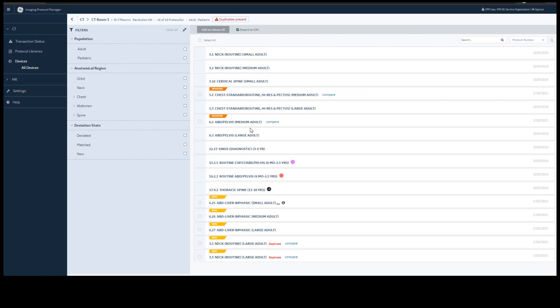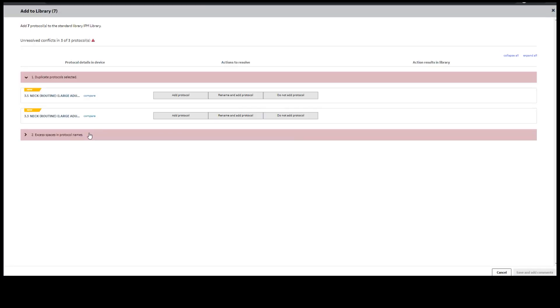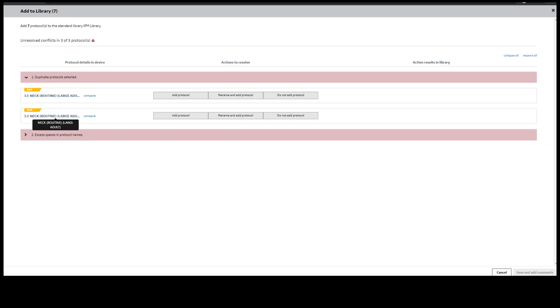Next, you can decide which protocols you want to add to your library. Select All protocols and Add to Library. This is a duplicate management screen. This will allow you to compare these two duplicate protocols and decide which protocol to add into your standard library.